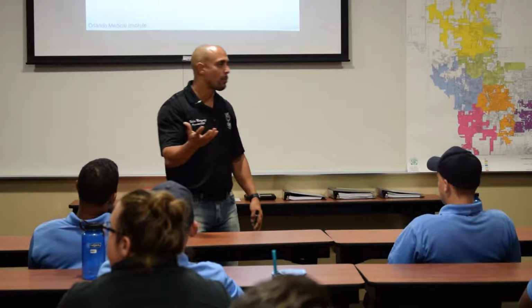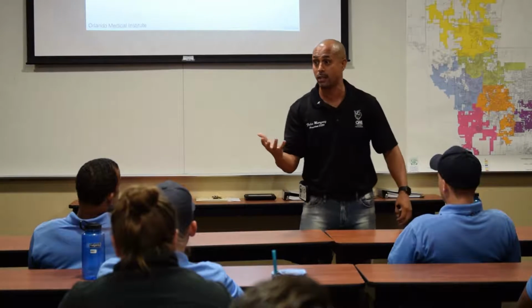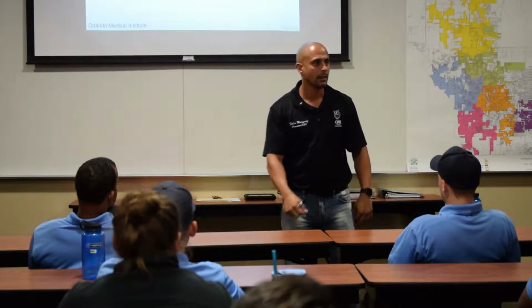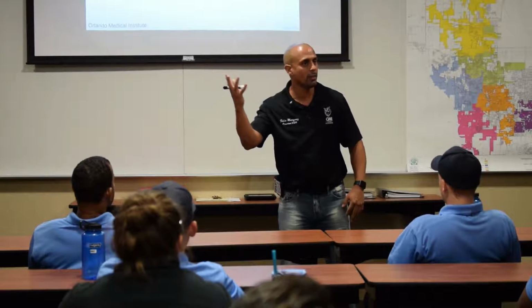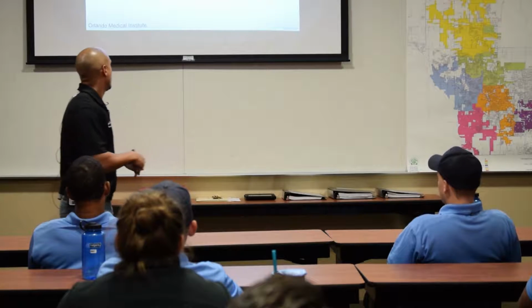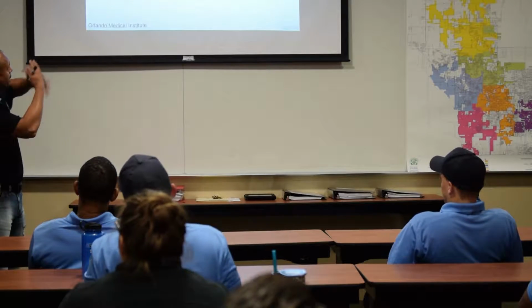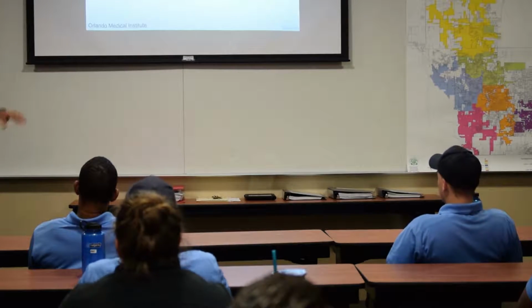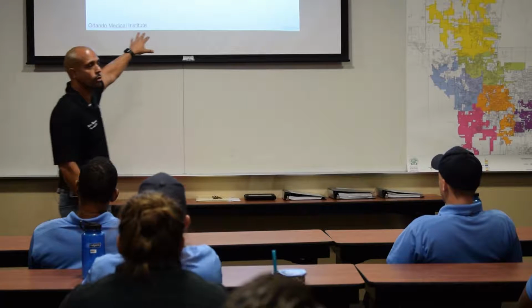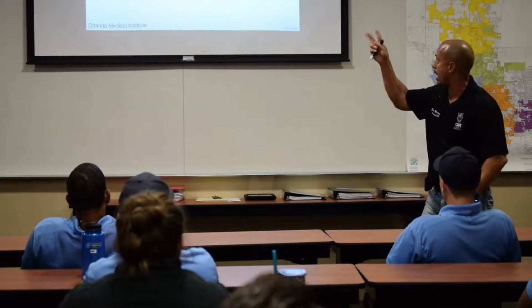We just wait till the blood pressure drops below 90 before we say, hey, this is a cardiogenic shock. And by that time, he already slipped on the banana. If you would have cut that 12 lead, you would have caught one foot in the grave and the other on a banana peel. We don't want him to slip. So knowing that, identifying axis deviation helps you out. Inferior wall MIs, ventricular ectopy, pacers, there we go. WPW again. If you notice, you saw it on both, right versus left.